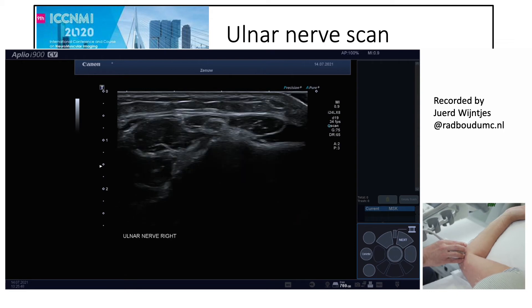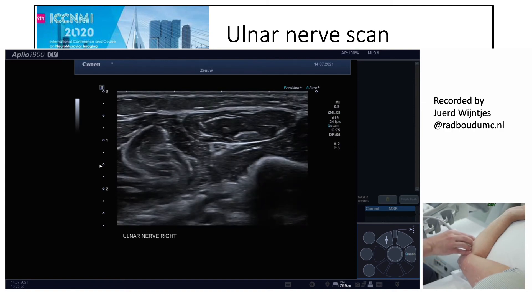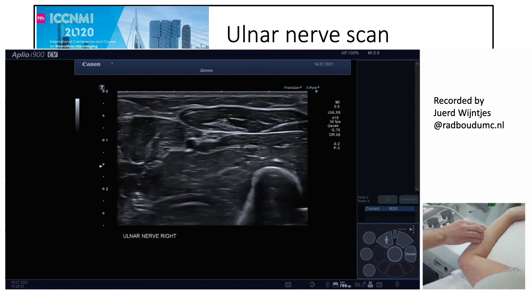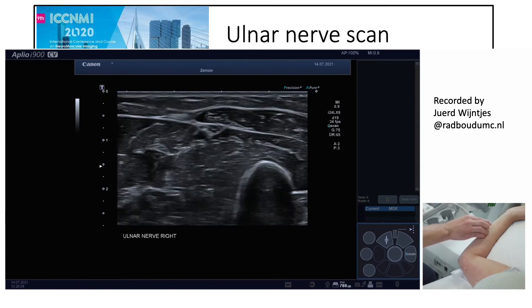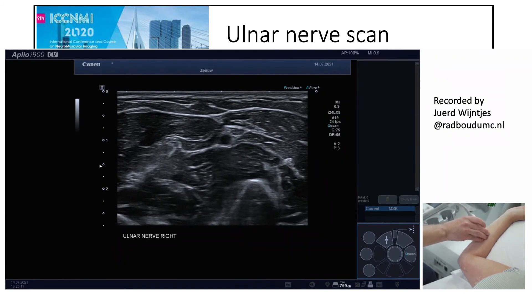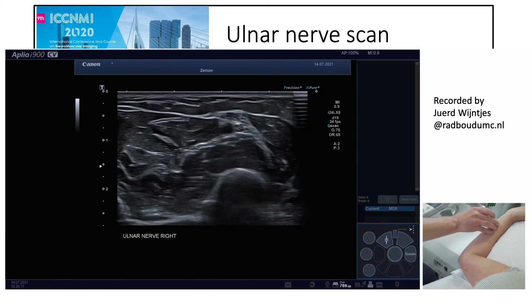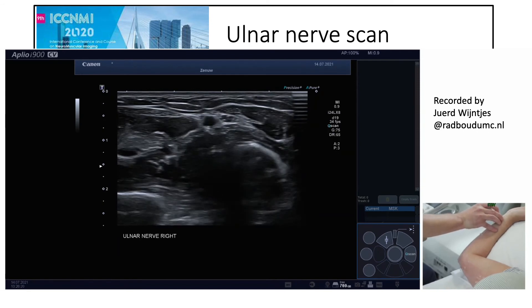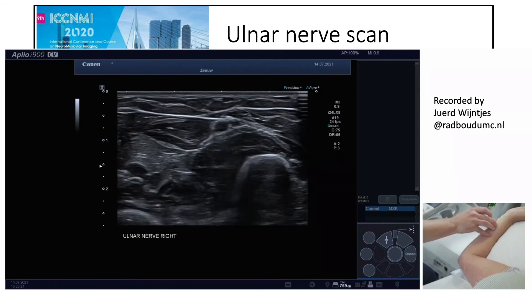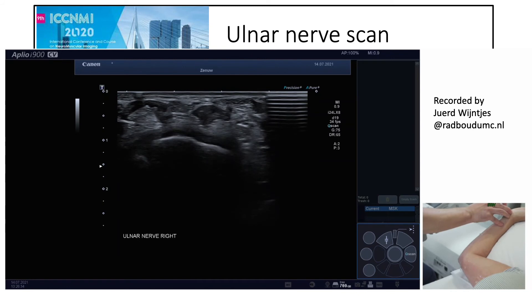This is also the most practical point to start the scanning session because the ulnar nerve is easiest to identify here. A bit more distally you can see the flexor carpi ulnaris above and the flexor digitorum profundus below, and now the ulnar artery comes near the nerve. We then move towards the wrist, and the dorsal branch can be seen departing.